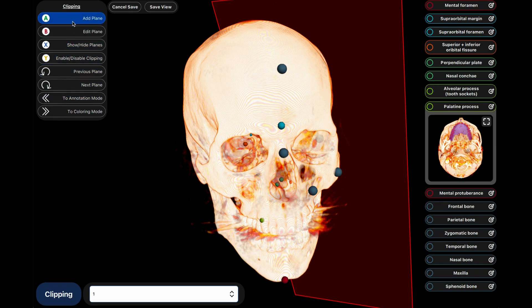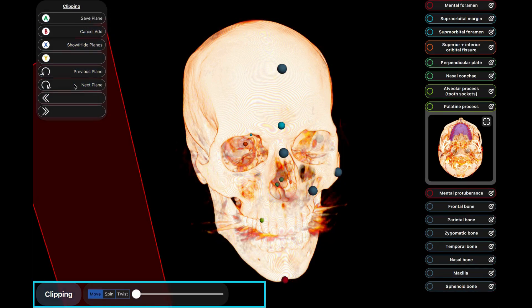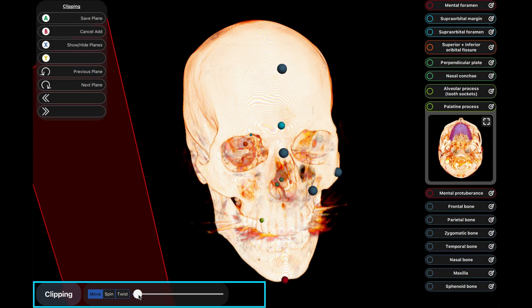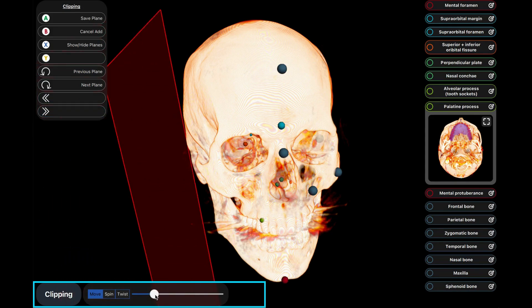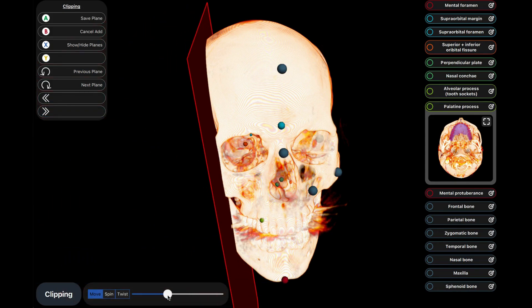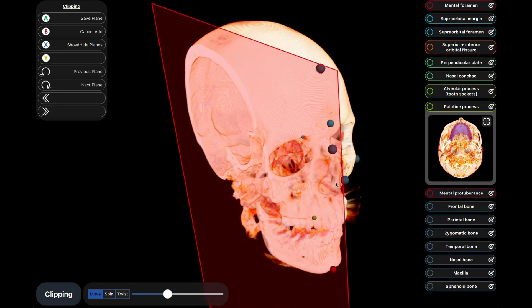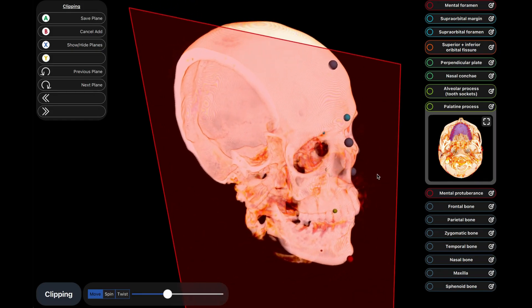Within the mode menu, there will be additional information located in the box to the right. The information in this box will change when you enter a sub mode and may have different actions you can perform, such as in tissue type and clipping mode.